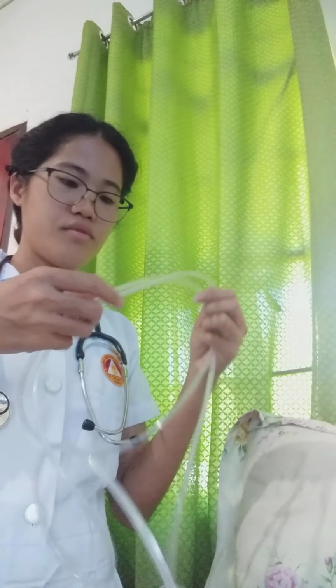Then we have to turn on the oxygen, this one, at the prescribed rate, and then we have to check that the oxygen is flowing through the tubing. To check the oxygen flowing into the tubing, we put it near the wrist or near the skin to be able to notice if the oxygen is flowing.